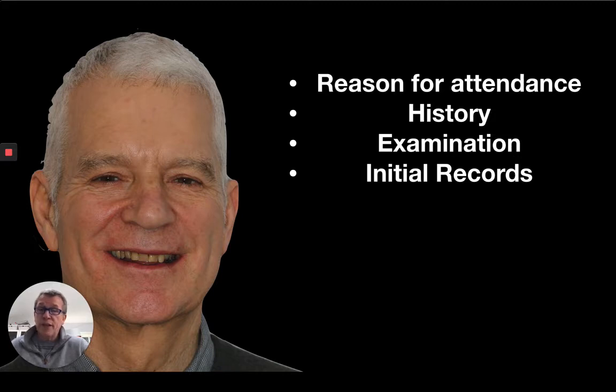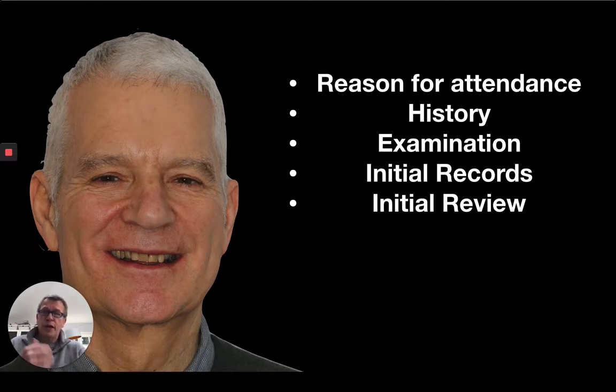We need some initial x-rays, whatever is appropriate for each patient. But then we can sit down and we can look at the photographs and we can look at the x-rays, sit with the patient. We can do what I call an initial review, where we start to have a conversation. And I'm trying to work out, where does this patient want to go with their treatment? Do they want to get a whole load of stuff done, really look at this whole picture? Or is it more of a biological approach, maybe a more single tooth approach that they're looking for?